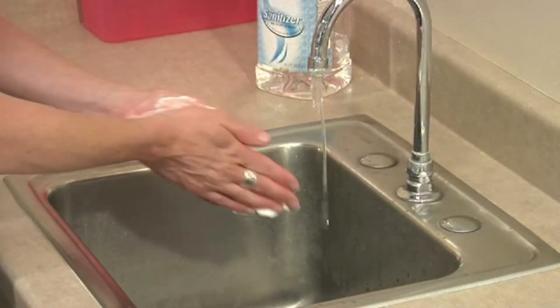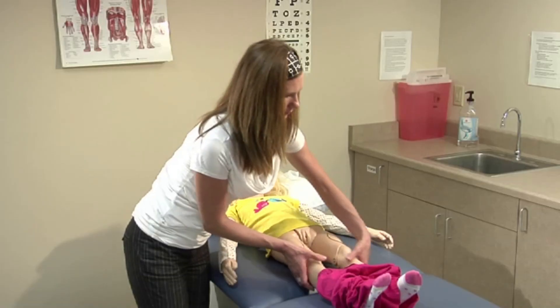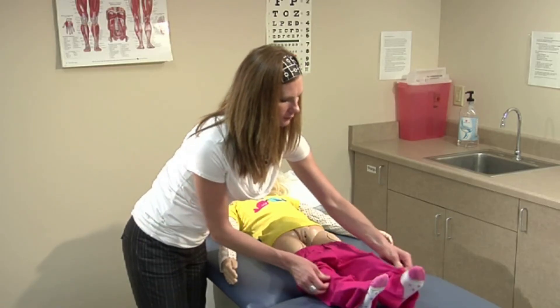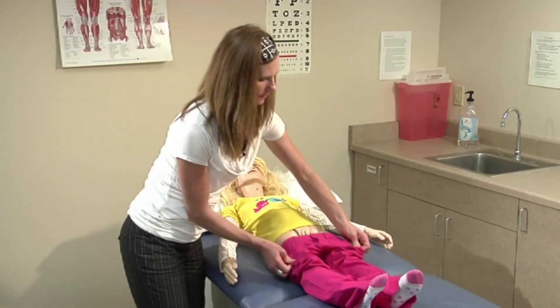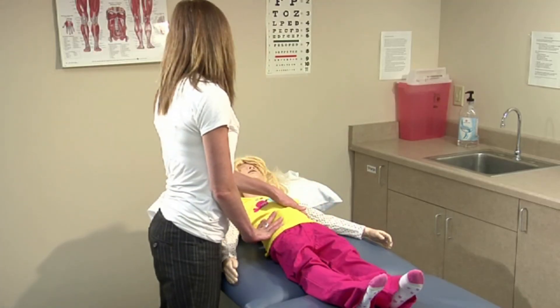Remove your gloves and wash your hands. Assist the student in dressing as needed. If ordered by the healthcare provider, measure the amount of urine prior to discarding. Discard the urine per infection control procedures and your school district's policy.